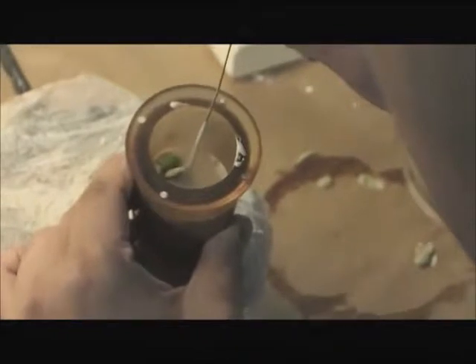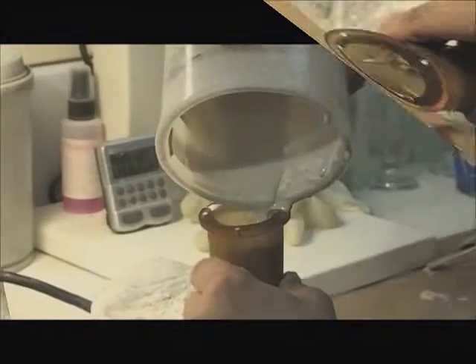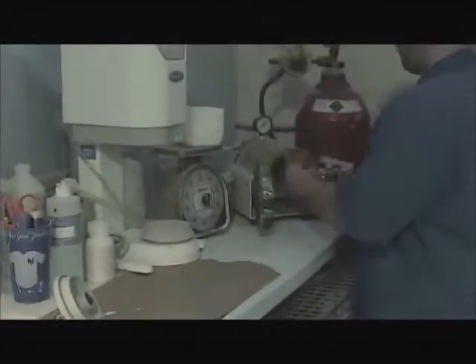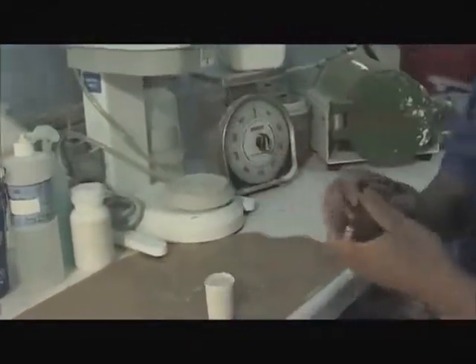Once filled with investment, the ring is placed in a pressure unit to further remove bubbles from the investment, resulting in smoother castings. When the investment properly sets, the mold is removed from the plastic ring and placed in the burnout oven where all wax gets eliminated and the mold becomes clean of gases and residue, so the molten alloy can enter the mold during casting.